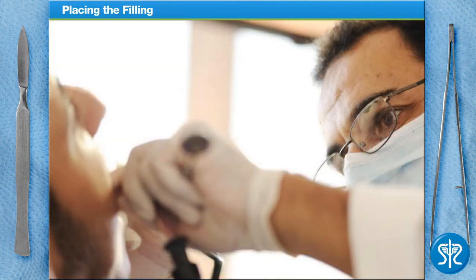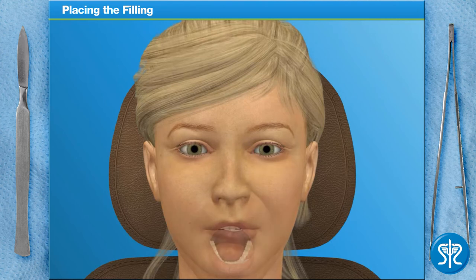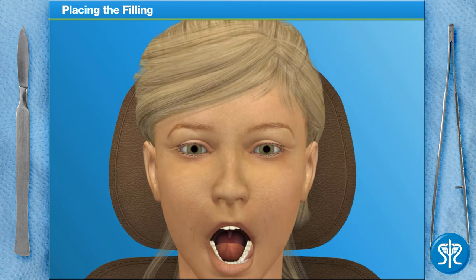At this point, the dentist checks the patient's bite to ensure that everything is normal and the patient doesn't experience any discomfort. Fortunately for our patient, you did an amazing job and there doesn't appear to be any issues with the filling or our patient's bite. All done — it looks perfect!